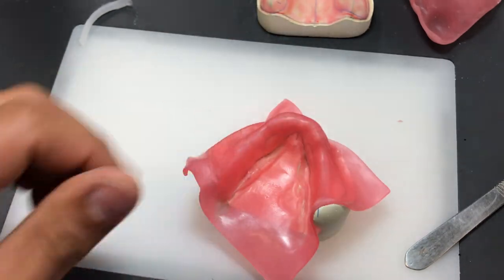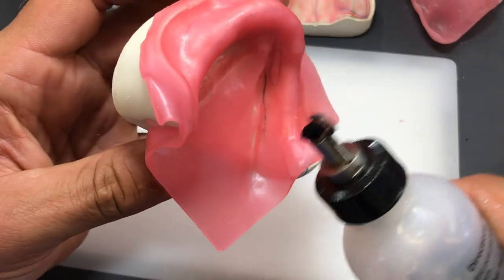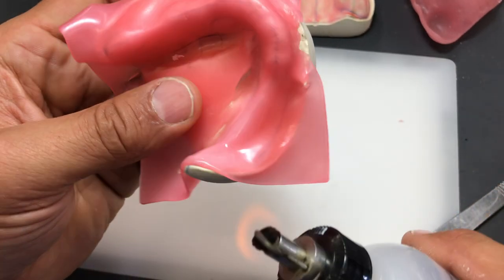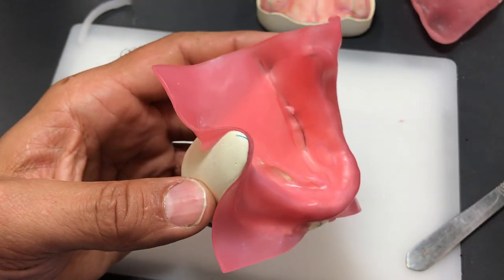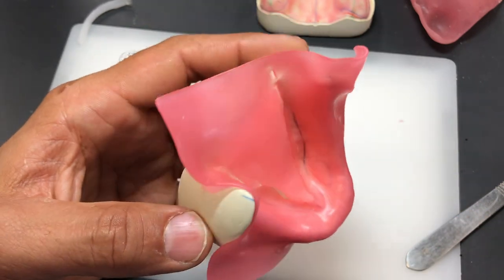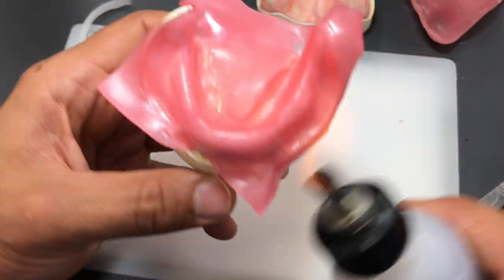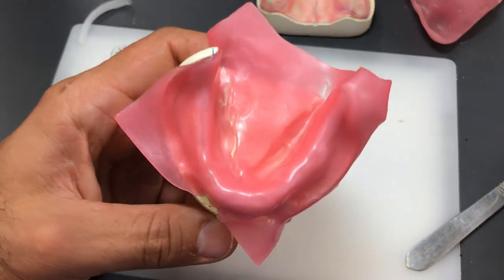So before I cut it back, once again, I'm going to utilize my alcohol torch to smooth out the wax, get rid of the fingerprints, and make everything nice and smooth.